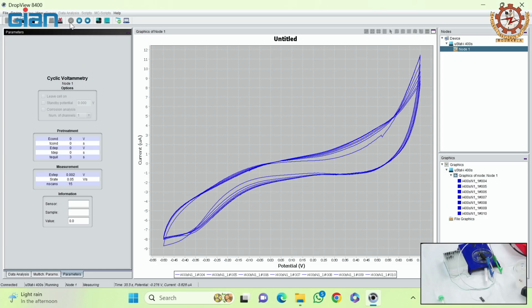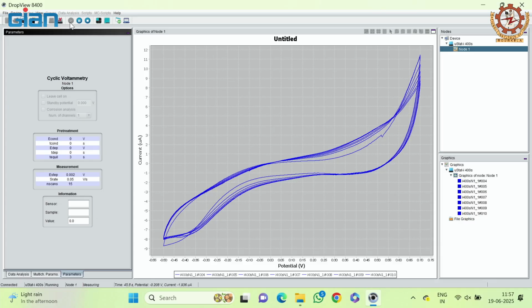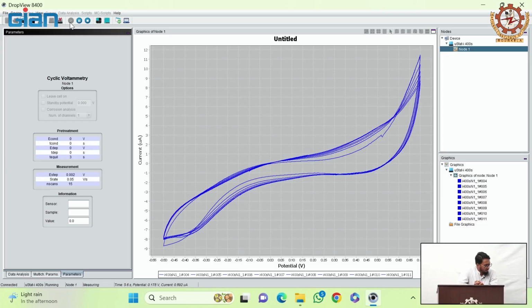So on the bottom of the screen, you can see the potential is changing, time is changing, so we have until now, you can see the time also. So after the functionalization is completed, or the electropolymerization is completed, we will proceed with the stabilization step, and once the stabilization is done, during the calibration we will be using the counter electrode that is located on the PCB.